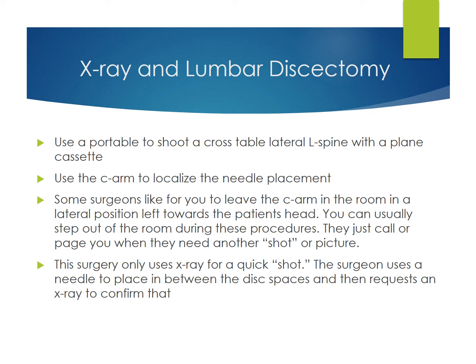The surgeon only uses X-ray for a quick shot. The surgeon uses a needle to place in between the disc spaces and then requests an X-ray to confirm that.